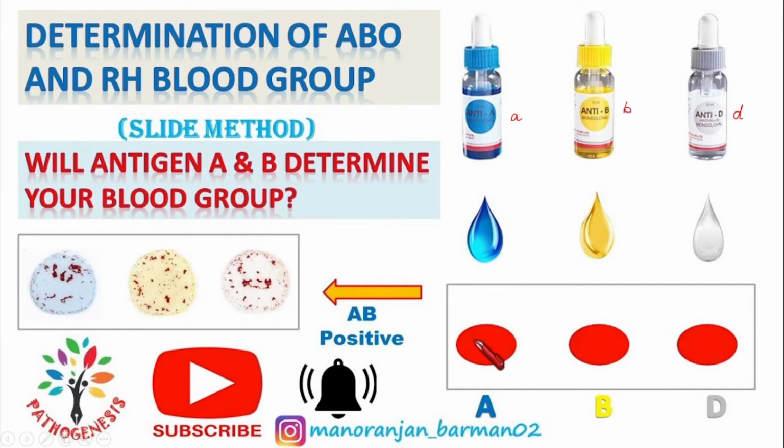After adding and mixing each drop with separate toothpicks, we can see the result here. What would be the result? We know that the blood group is AB positive. Okay. Let's see.